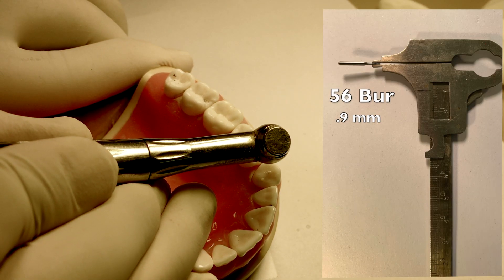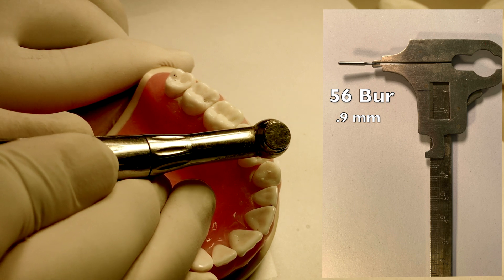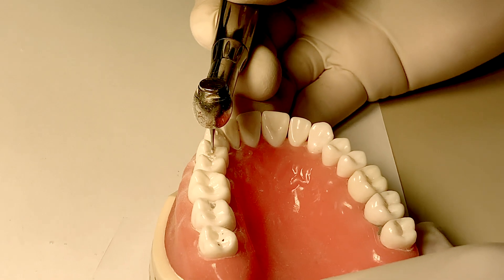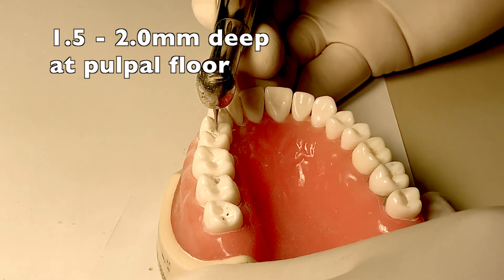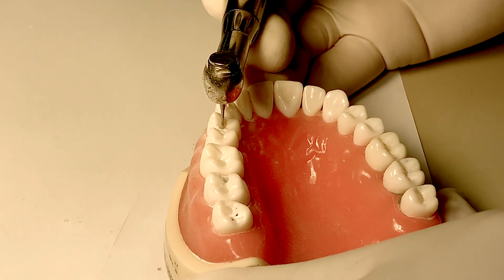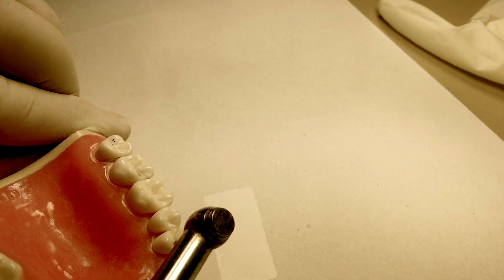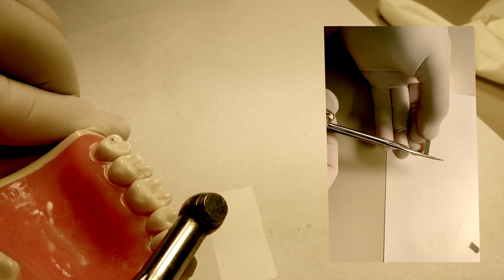In this video we'll be using a 56 carbide burr with a 0.9 millimeter diameter. The first key measurement is the 1.5 to 2 millimeter depth of the pulpal floor. Another key measurement is the 1.5 millimeter depth at the proximal axial wall. Be very careful during the extension of the prep — a piece of matrix band can be used to protect the adjacent tooth.